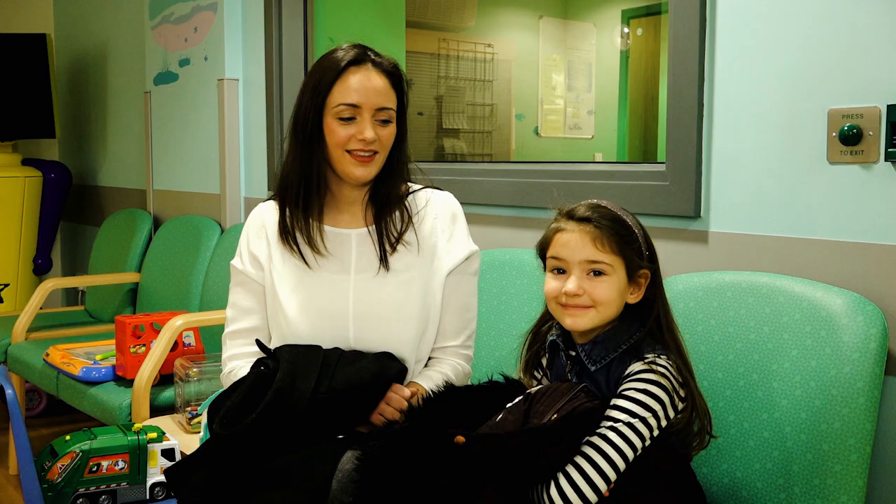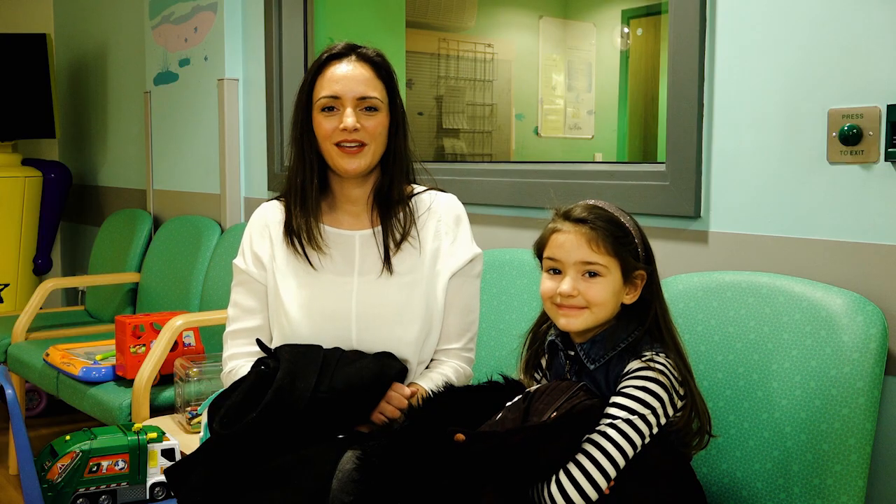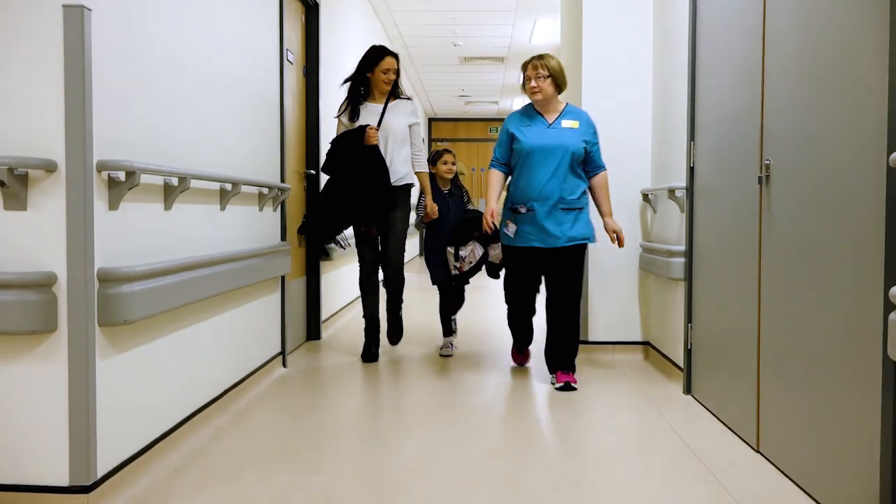Hi, I'm Karen and today Scarlett and I are going to show you what happens when your child needs to come to hospital for a DMSA renal scan.